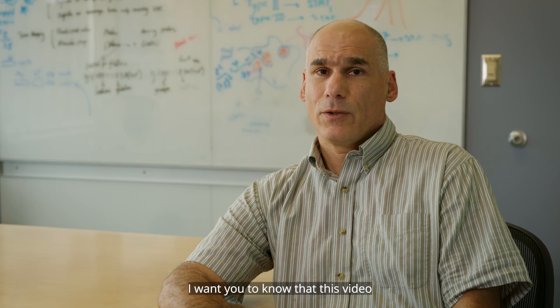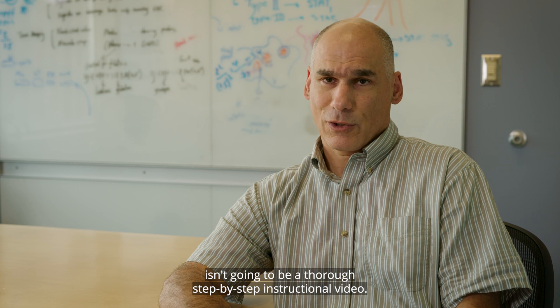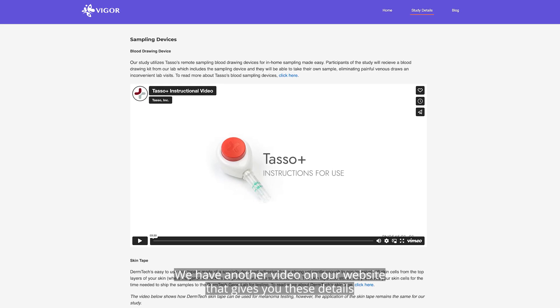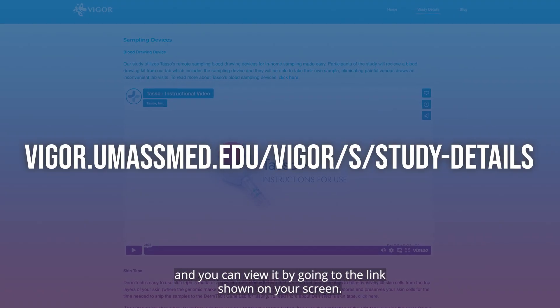Before I get started, I want you to know that this video isn't going to be a thorough step-by-step instructional video. We have another video on our website that gives you these details, and you can view it by going to the link shown on your screen.